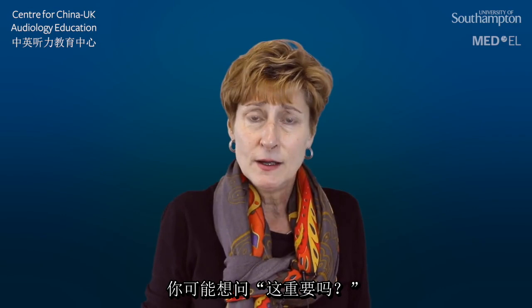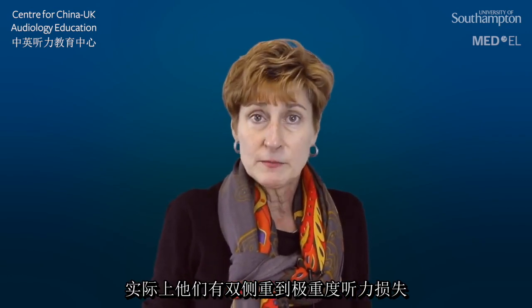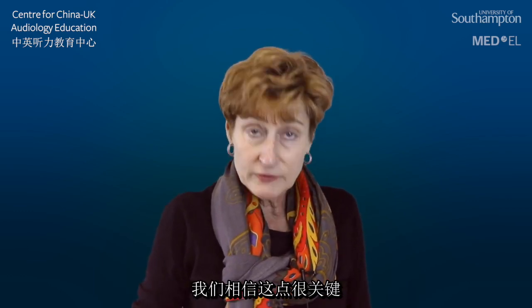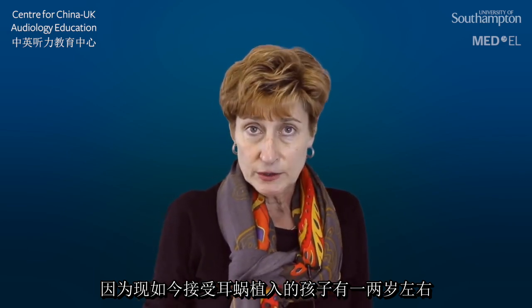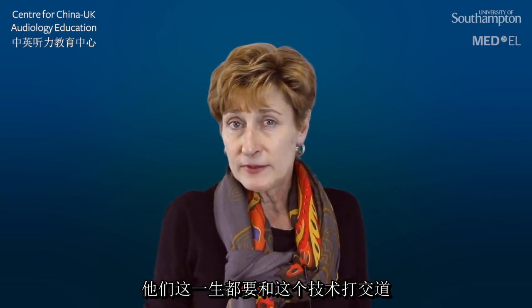Now you may say, why is this important? Because most of your cochlear implant recipients don't have residual hearing. In fact, they have a severe to profound bilateral hearing impairment and may have little or no measurable hearing. Well, we believe it's important because the children that you're implanting today, at 1 year and 2 years old, will be living with this technology throughout their lifetime.